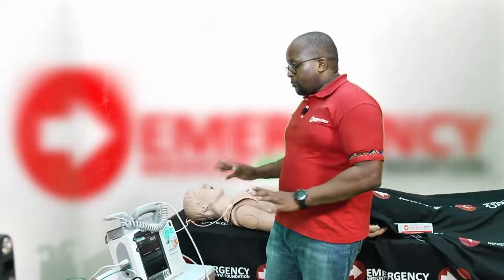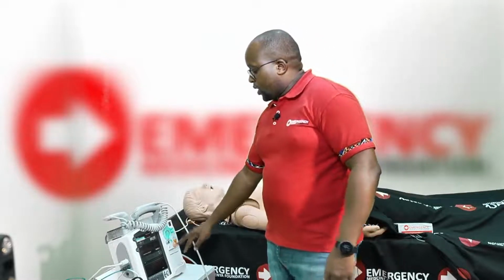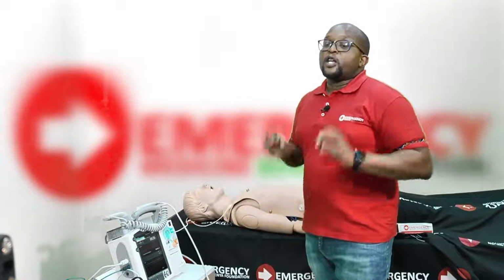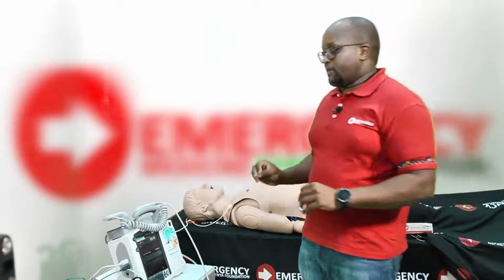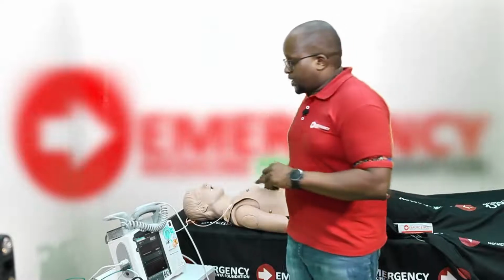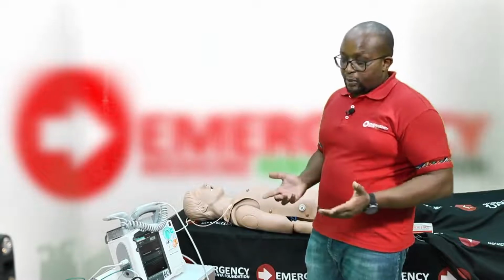The good thing about using pads, for example, is I can do it remotely by just pressing 1, 2, and 3 without interrupting CPR, and only having the person doing CPR put their hands up. You do not want anyone touching the patient when you're shocking them, because the shock has the potential to transmit from the patient to you. So you'll get shocked and very little will get to the patient, and yet the patient is the one who needs it. And more importantly, that becomes harmful to the healthcare providers working on the patient.